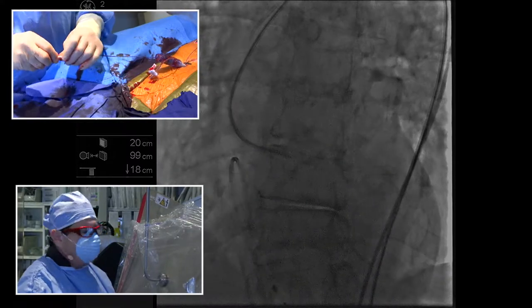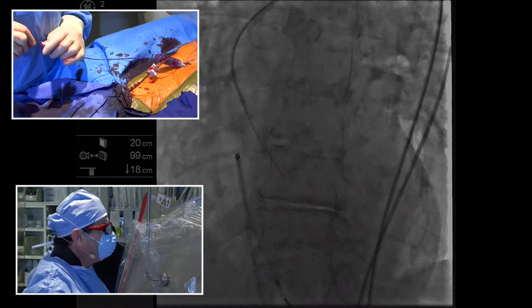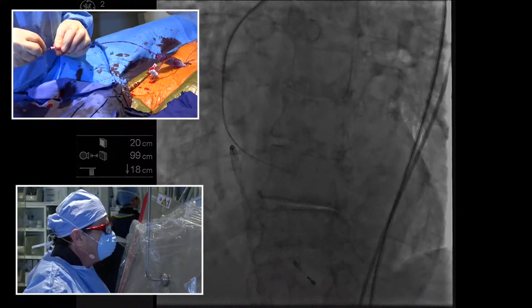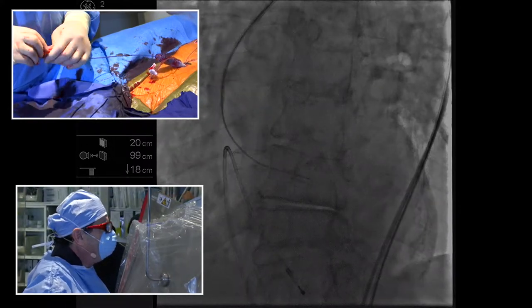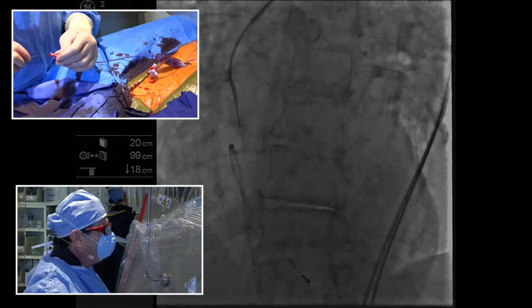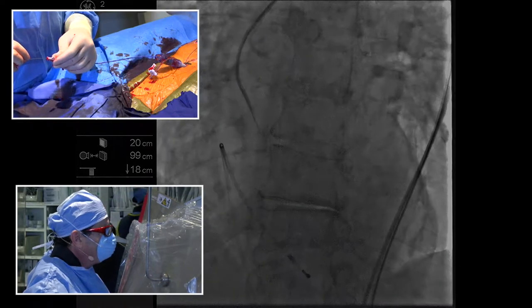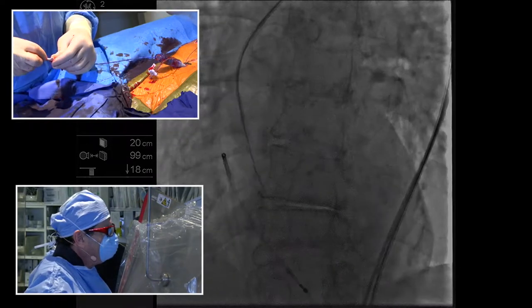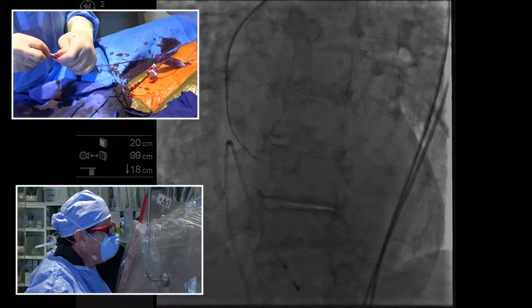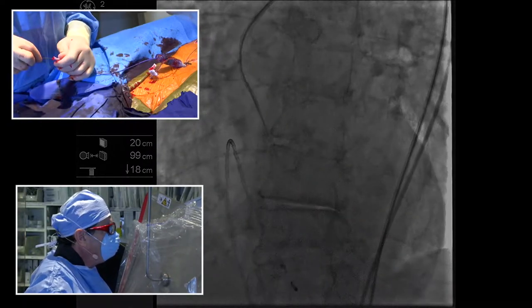So you have a Terumo, straight Terumo wire? Yeah, this could be very boring. All right. I'm bored right now. Let's see, yeah. Right here. I see the jet there. You see that? Yeah. I think that's the jet. Yep. But I don't know that's really helping us. It's so far away from the valve. So either this is just too tight and the wire won't go through.